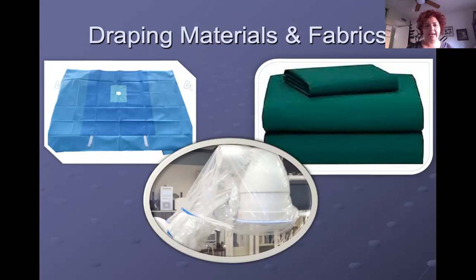Okay, so the last type of drape is the plastic drapes, and this is a C-arm drape, but they're commonly used to drape microscopes or the Da Vinci robot in addition to the C-arm. Also, there are a number of what we call isolation drapes, and they're a clear plastic drape that either have some sort of fenestration. What's a fenestration? Who knows?